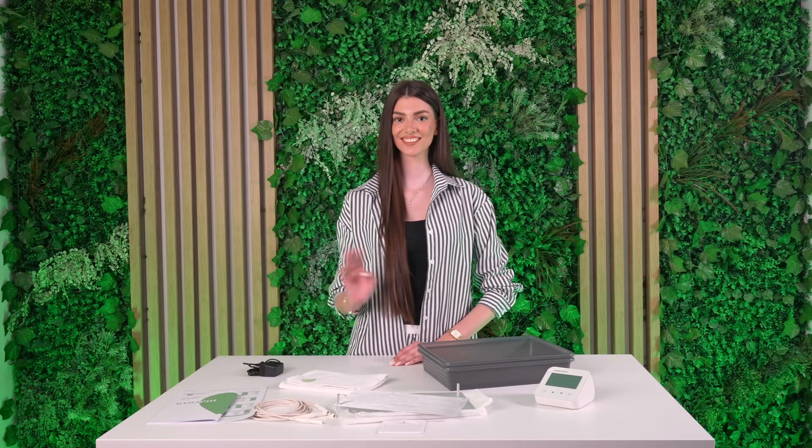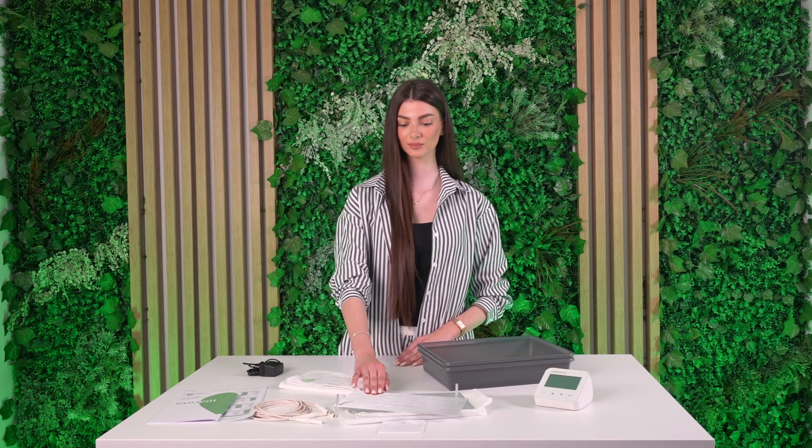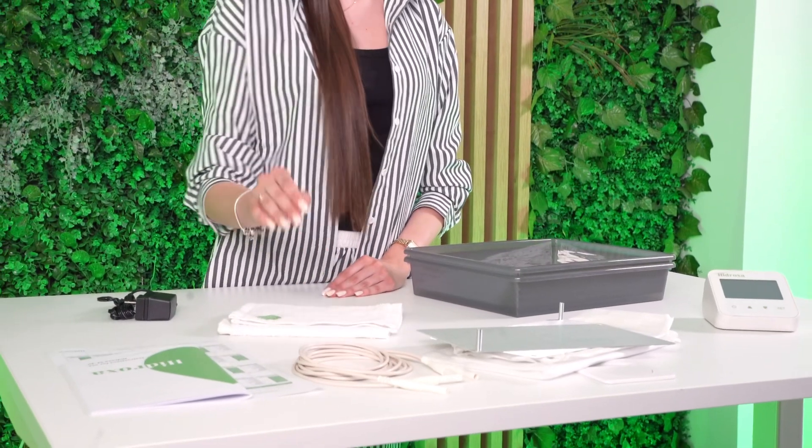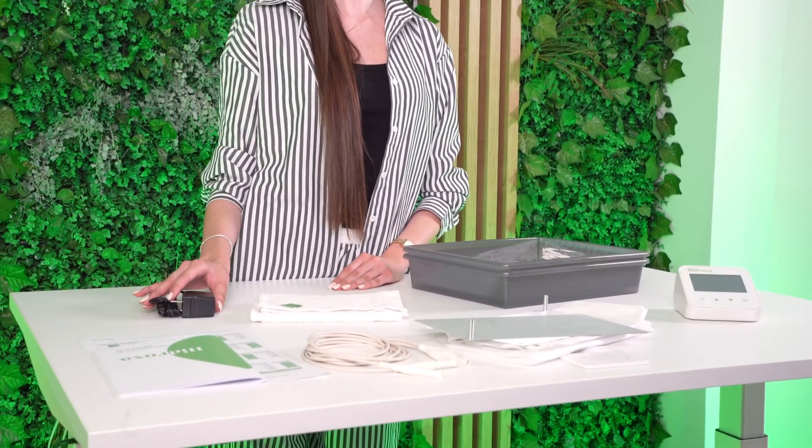This is everything included with your device to treat your hands and feet: the main unit, a pair of metal electrodes, water bins, a pair of connector cables, a pair of towels, and a power adapter.